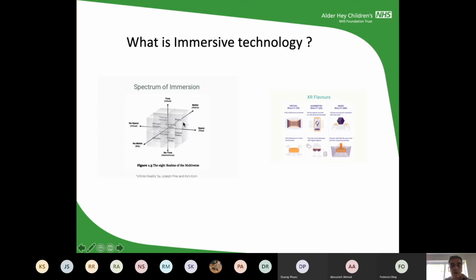But immersion is a complicated thing. It's all physics. But there are, if you want to call it, three flavors: virtual reality, augmented reality, and mixed reality. Virtual reality is the one where you put on the goggles, as I showed in the Innovation Center, and you cannot see anything, so you're in a completely different world. That's all virtual. Augmented or mixed reality is when you mix both. With the HoloLens that we have been trying the last few days, you are walking around, you can still see everybody else around you, and you have holograms in front of you. So two different things and two different applications.